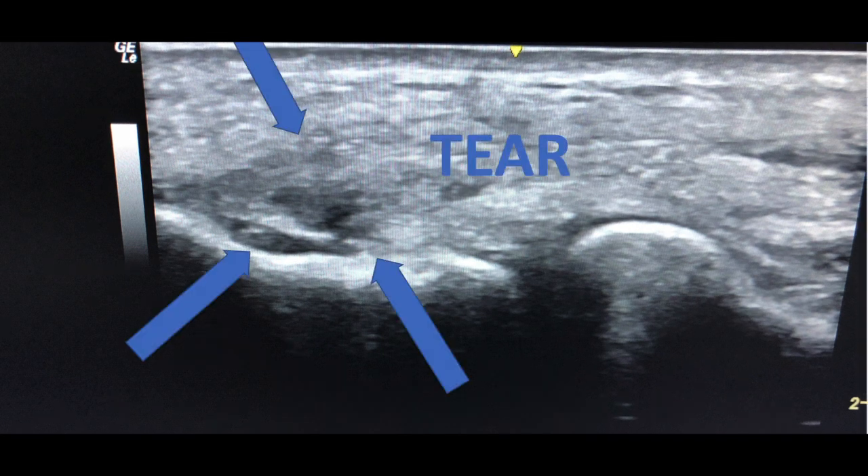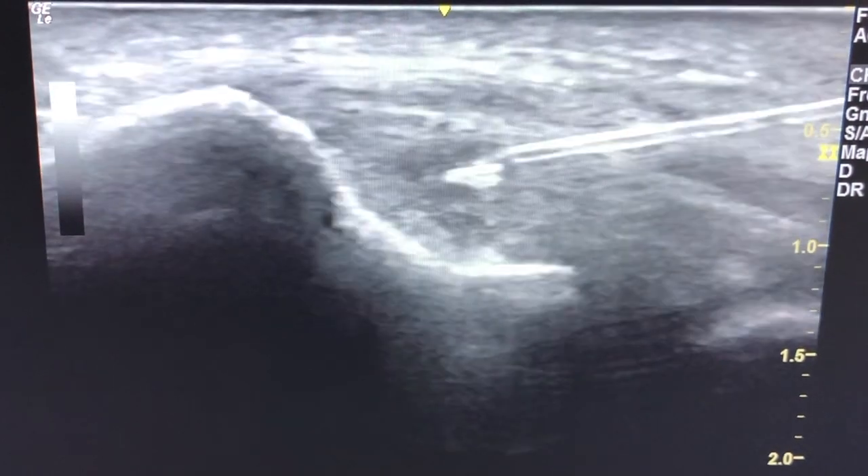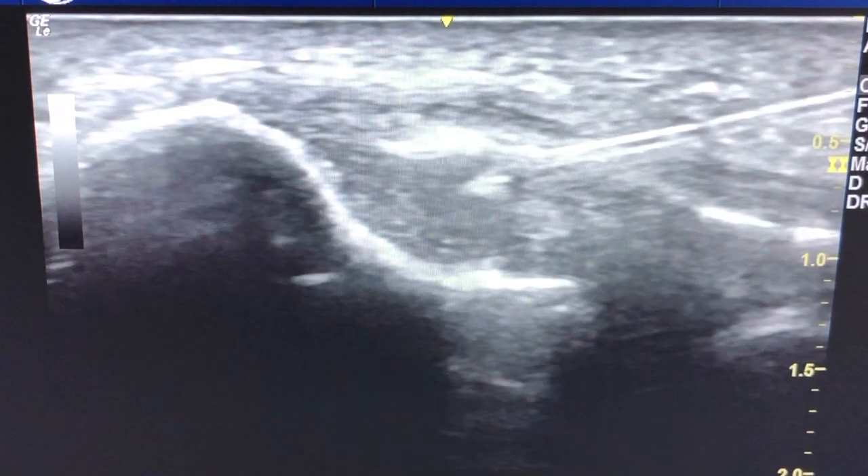We can clearly see the defect of the tendon. Now, if you want this treatment to work, we have to be able to put these cells inside of the tendon tear. As you saw in the prior video, here's a zoomed-in shot of that deployment of these regenerative cells that are rich in growth factors, that are going to heal the tendon from the inside in.